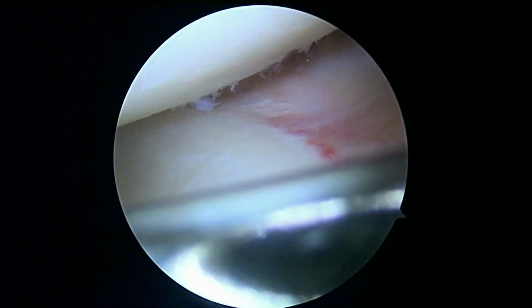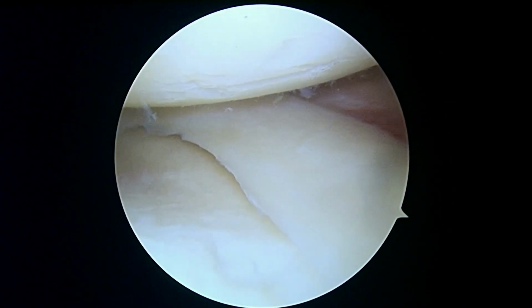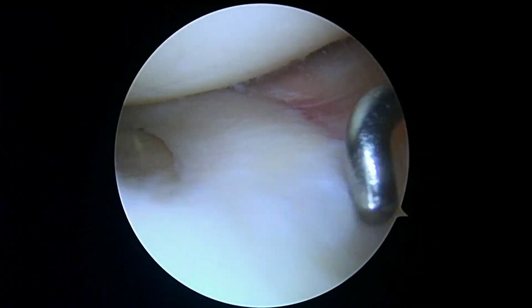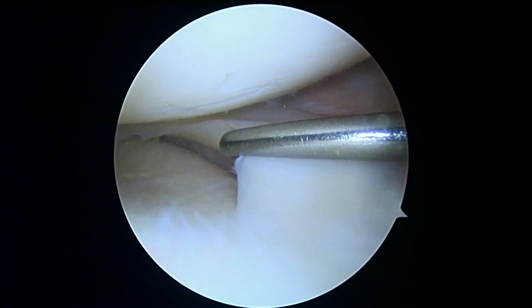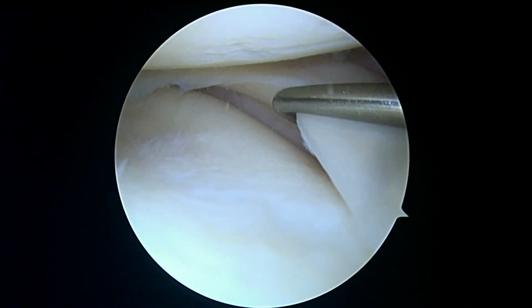We're just getting started on the right knee. We're looking in the medial compartment first. This is where we were concerned about the MRI scan. This is the anterior horn of the medial meniscus. It looks great. We can lift up on it. It looks like it's solidly attached all the way around.